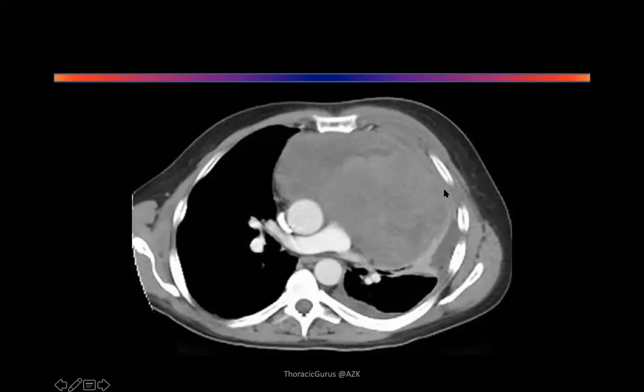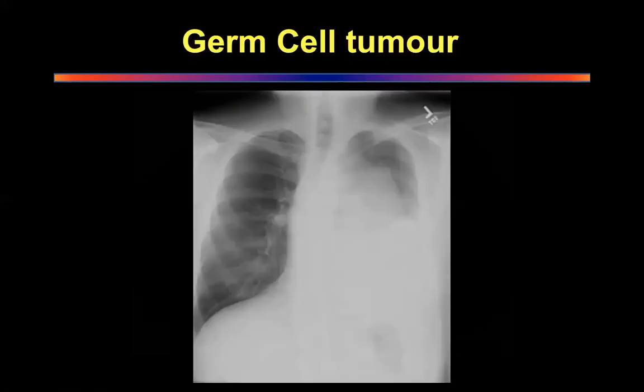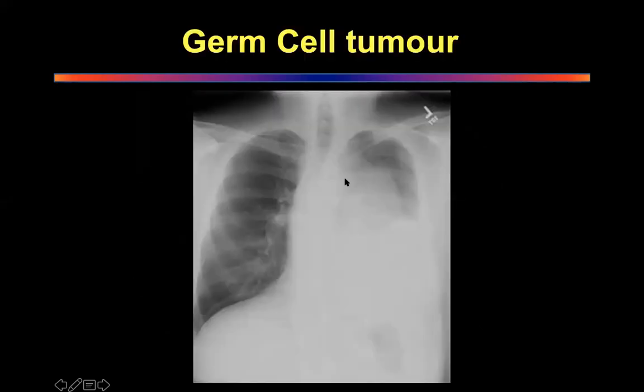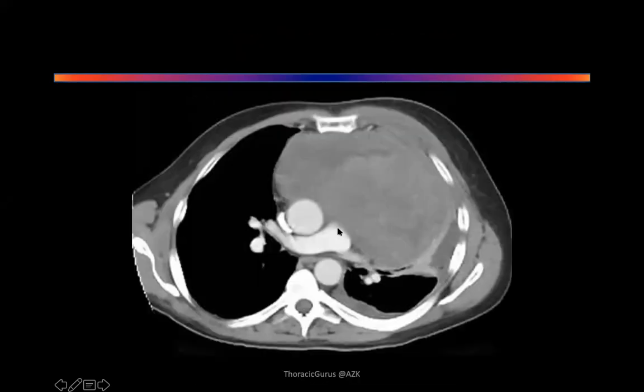What is happening here? The complete collapse of the left lung there. And there's a thick capsule, a little bit of calcification in the capsule. Yeah, but more than that, it's the collapsed lung that is giving you the impression of a capsule. What's happening here? Pleural effusion. Excellent. So you agree that the picture which you told me was a pleural effusion is not correct, because really there is very little pleural effusion in this patient. You understand? That's why I was sort of shocked when you said pleural effusion, because this is all mass. It looks very lobulated. This doesn't look like there is effusion. But on a CT, it's quite clear that there's not much effusion. Differential diagnosis.